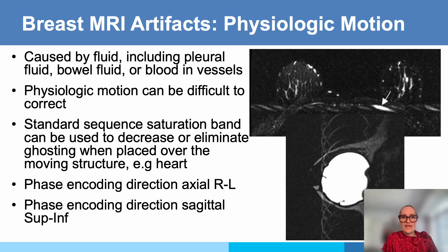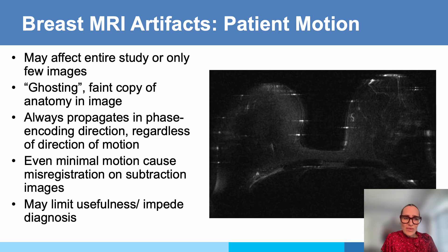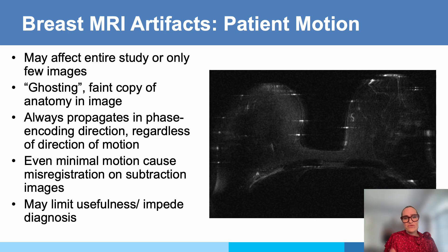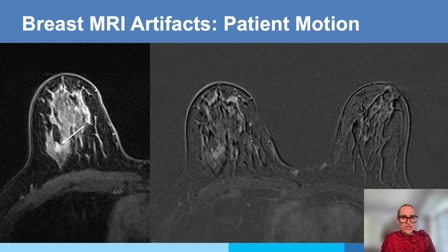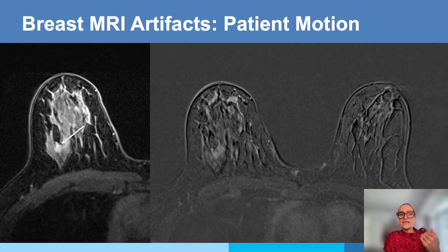Even minimal motion will cause misregistration, particularly evident in subtraction artifacts, which may limit usefulness. Patient instruction is usually the best mitigation. Here is an example where we have patient motion — the subtraction image was not optimal, but we have the source image with fat suppression where we can see the lesion and go back to the subtraction. In this case it was a small fibroadenoma that we then also saw on ultrasound.